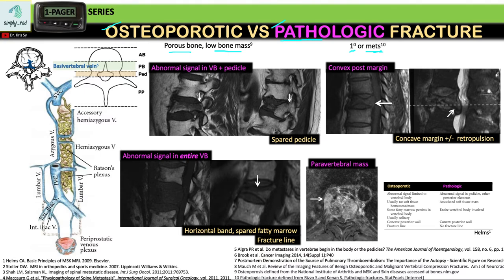The first sign is abnormal signal in both the vertebral body and the pedicle. In this T1-weighted study, there is abnormal signal in the vertebral body, and when you scroll through, the pedicle is also involved — so this is the pathologic fracture. In contrast, this other case shows abnormal signal only in the vertebral body but with sparing of the pedicle. So why is this?